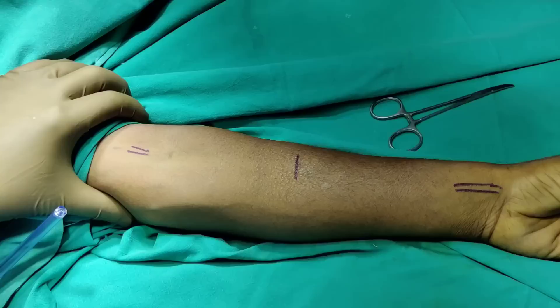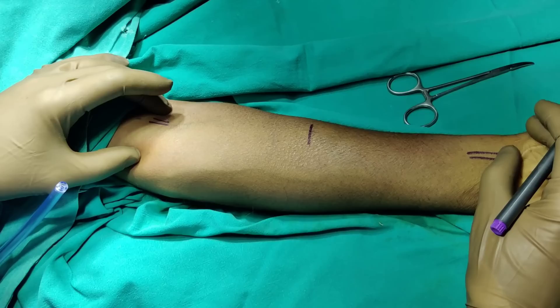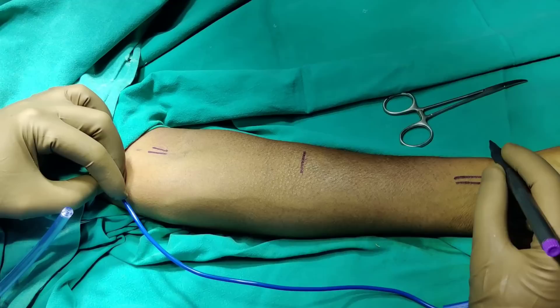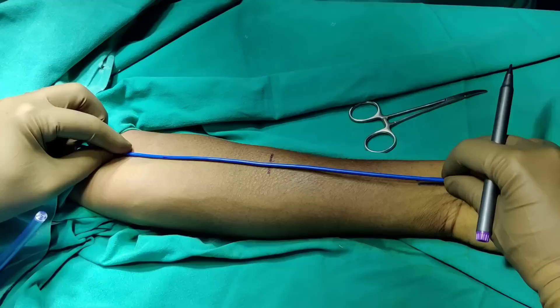The next step is to mark our skin incision. The landmark is the bicep tendon — you hook the bicep tendon and stay lateral to it. You don't want to go medial to the tendon because the artery is medial. Now historically, the books say mark it distally using the brachioradialis, but I do a slightly modified version in which we take the FCR, not the brachioradialis, as our landmark for the incision.